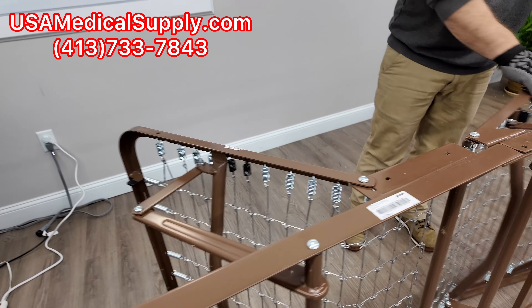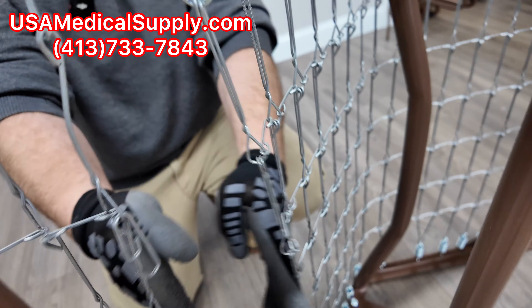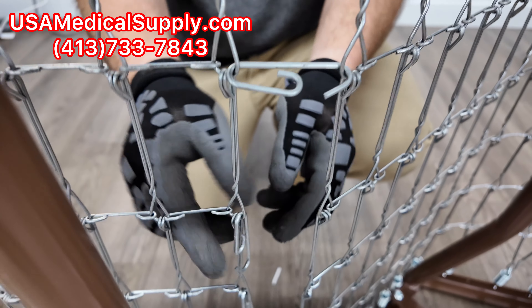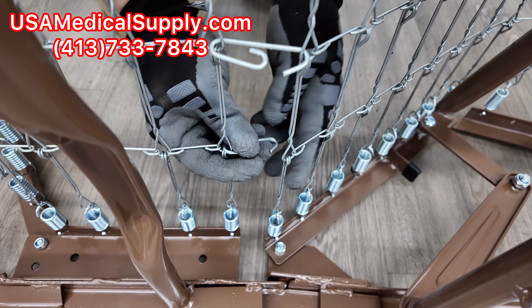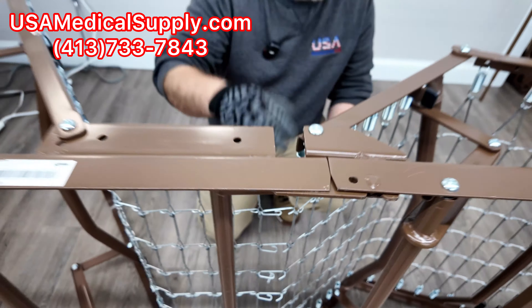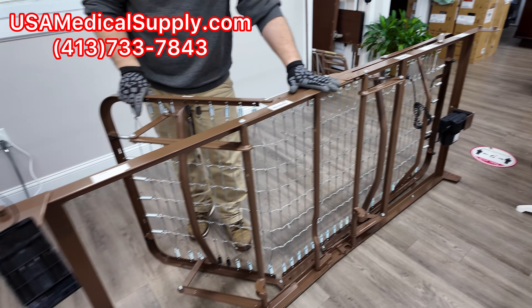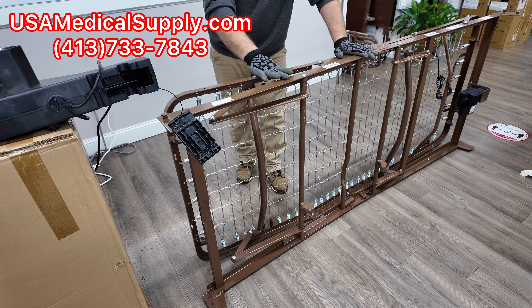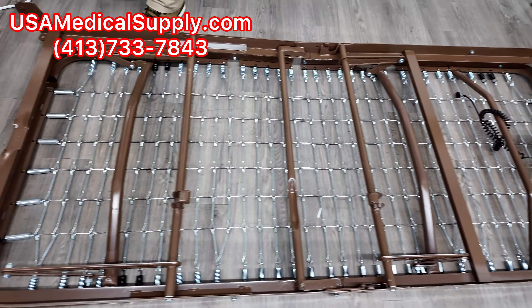Raise it up on this side, and I'll show you why: you have to lock these wires. Now you're locking this section where the mattress would be — you've got these eyes, or hooks. That's done. Next, you can put it down to make things easier, though you can leave it upright for efficiency if you don't want to raise it twice. If you put it down, the motor goes in here.